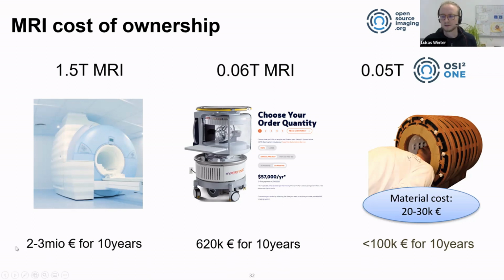So then you have a certain amount over the years, and then an innovation comes like low-field MRI, for example, that got a bit of a boom recently, like this Hyperfine system. And yes, it's cheaper, but it's also not that cheap. These are still the old prices. I think they went up a little bit, but you can see you pay a bit less, but you also get less, not in terms of the functionality you get.